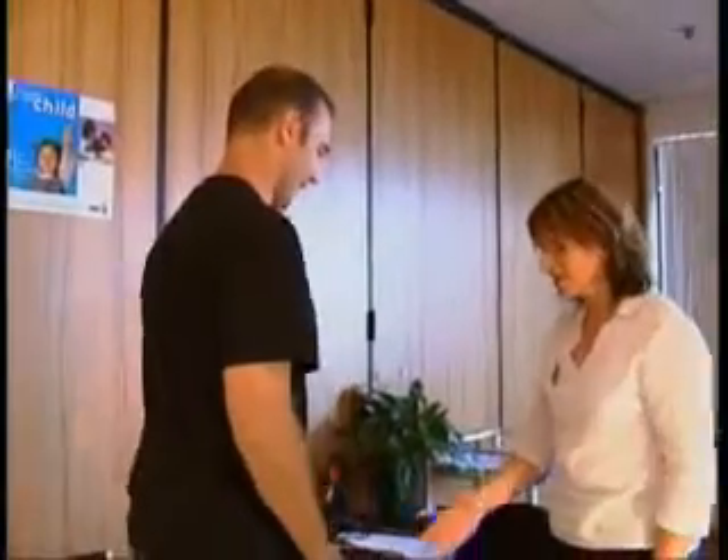Hello, Nick. Take a seat. My name's Angela Stewart. I'm a registered nurse, and I understand you've come to have your blood pressure checked today. That's right. Thank you. Nick, have you ever had your blood pressure checked before? No, so this is the first time. I'm just going to wash my hands, and then I'll explain to you what I'm going to do.